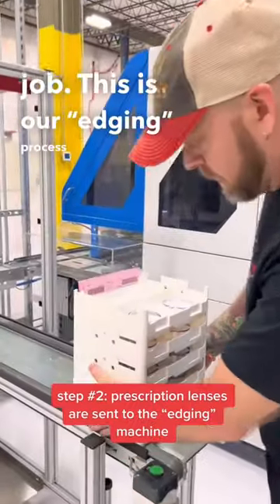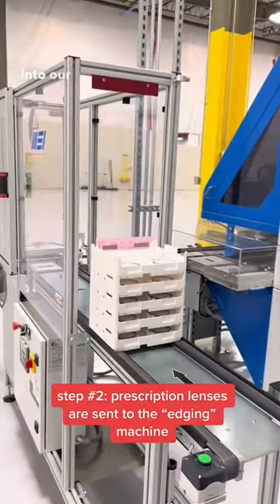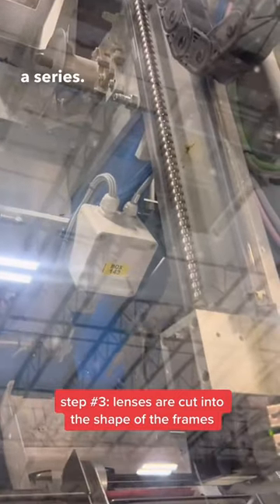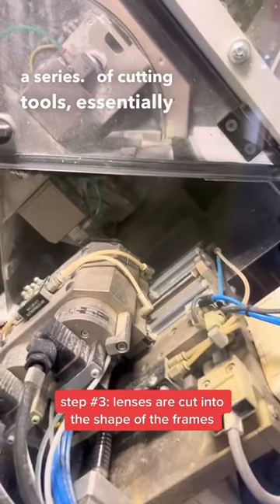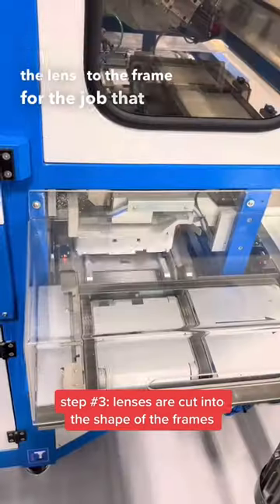So this is our edging process. We're placing a stack of five trays on the line and sending it into our edging process, where it will cut it down to the shape of the frame, running it through a series of cutting tools essentially that will shape the lens to the frame for the job that is being processed.